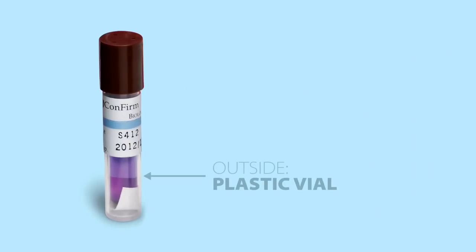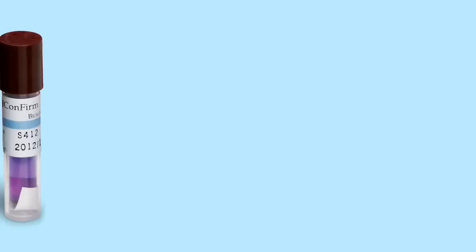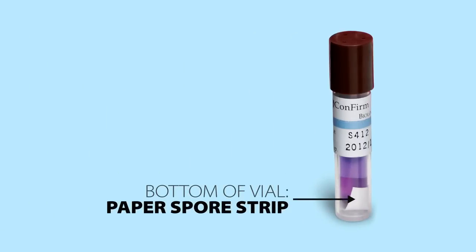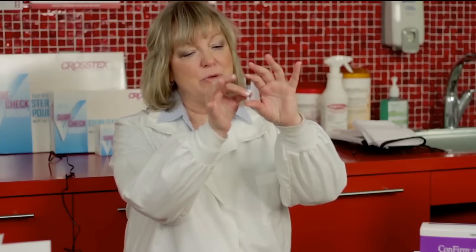If you'll notice in this vial — on the plastic vial on the outside — it contains a small glassine-like vial on the inside that's holding the tryptic soy broth, which is the nutrient fluid. You'll also see at the very bottom of the vial is a white paper strip. This is actually the spore strip. What has to happen once this vial has been processed in the sterilizer is we have to get the tryptic soy broth out of that ampule so it surrounds the spore strip.